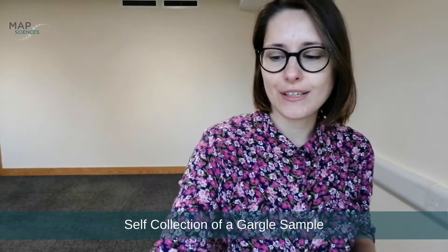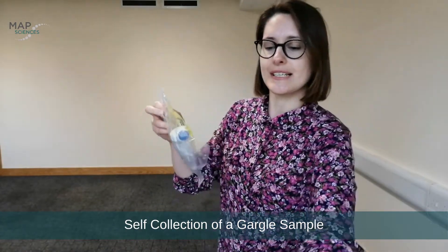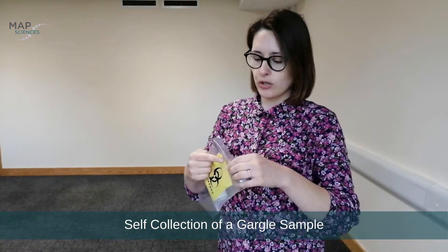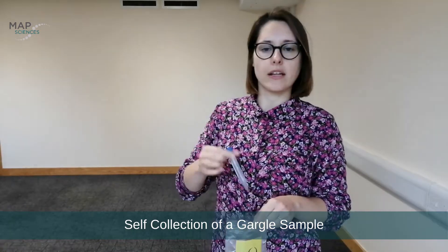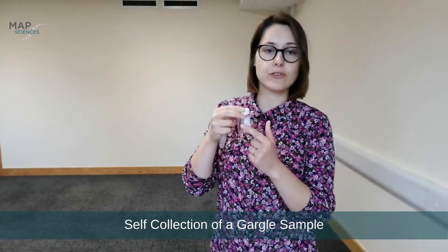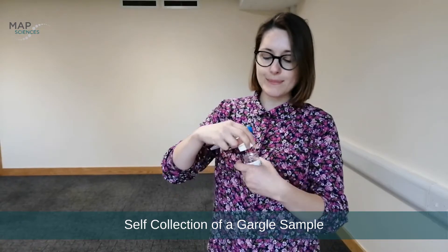So what does the test include? You have received the envelope, and inside there is a bag with just 10 milliliters of plain water and the sample pot. Open the bag, take out the water, and make sure you fill in your name on the slip provided so you know who the sample belongs to.